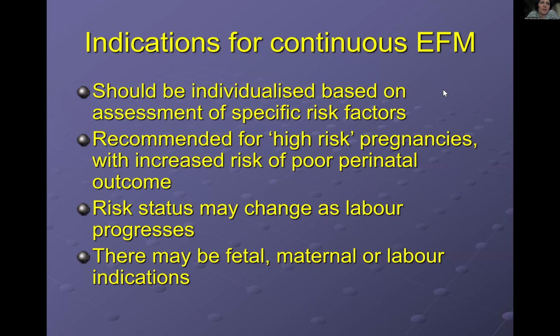Now, what about continuously doing electronic fetal monitoring? So, the guidelines say that it should be individualized based on specific risk factors. So, if someone is at high risk, especially of having a poor perinatal outcome, that is, babies at risk, or if you have a low risk patient, but during labor, the risk status changes. For example, she starts experiencing bleeding, or the blood pressure goes up, or there is slow progress. So, yes, there are fetal and maternal labor indications where you need to assess continuously.